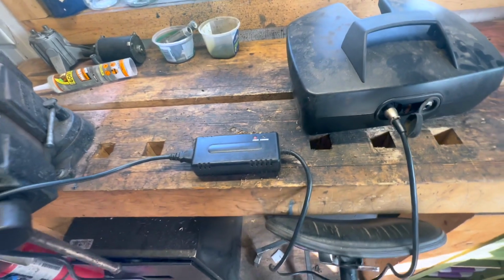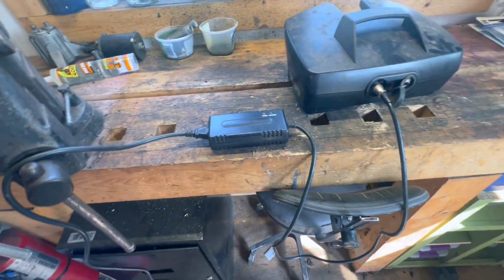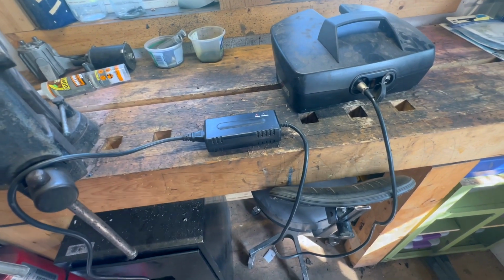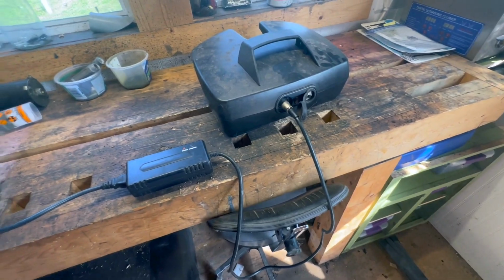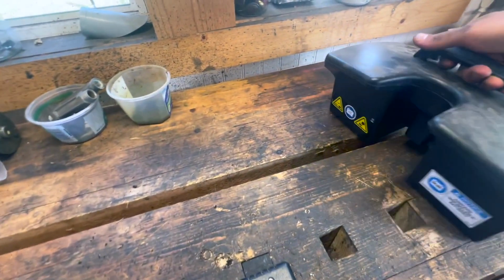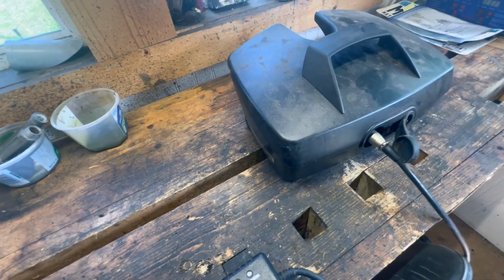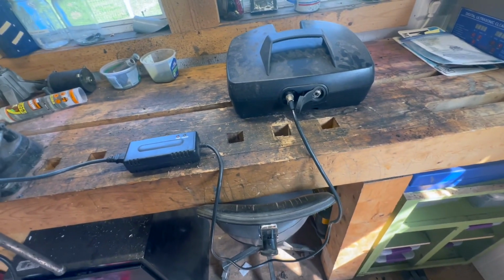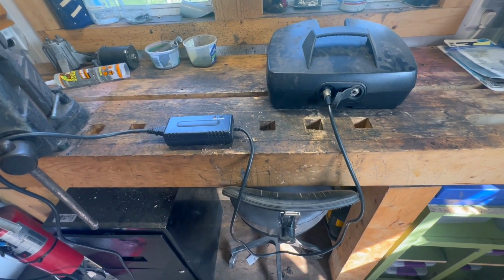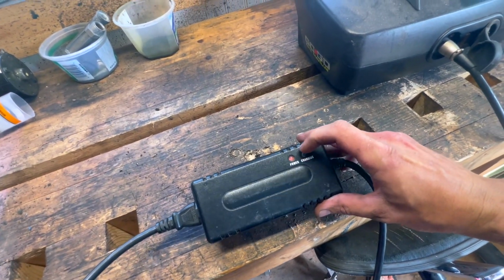So here's the battery pack. Came with a charger. I don't know anything about these types of machines, but it was small, and like I said, they were giving me something pretty cool, so I thought I would take this off their hands as well. I figured that if we get this thing running, maybe I'll just donate it to somebody who's in need of one. But the problem is, you can see we've got power, but we're not charging.